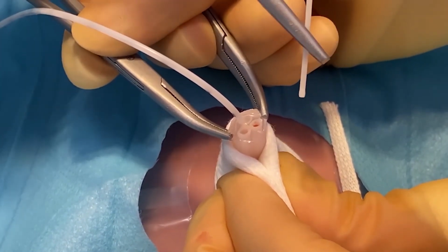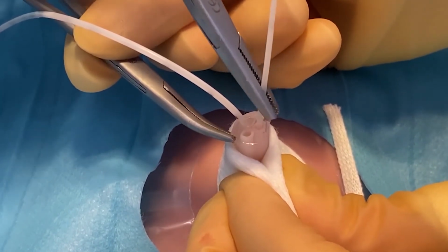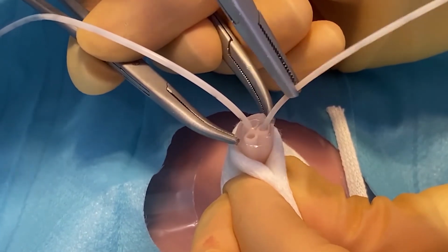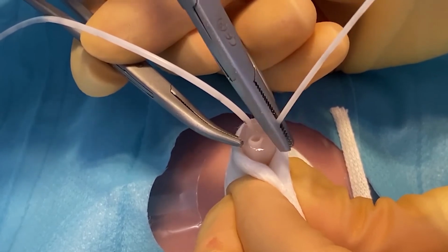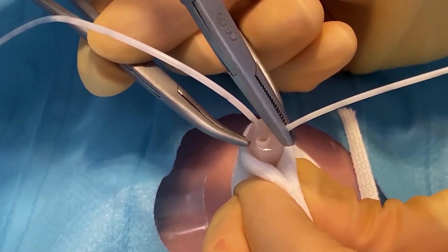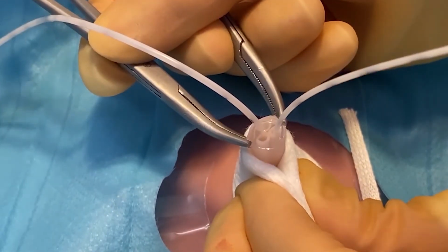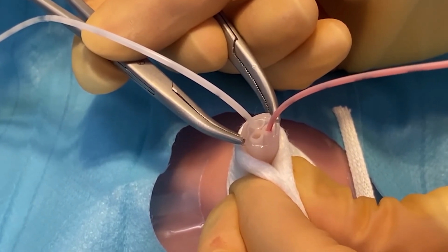And you may find it easier to do this with some forceps to get a little bit more control. And again, we're going to insert that to the desired length using the numbers on the side of the catheter. And again, once you're in your desired length, simply pull back on the syringe and you'll aspirate blood.